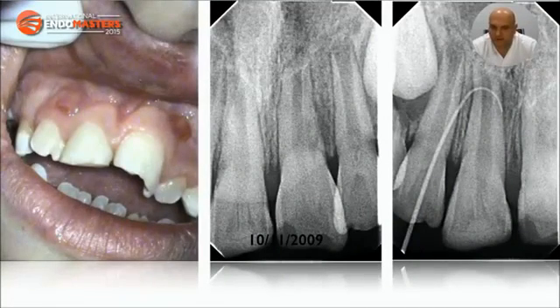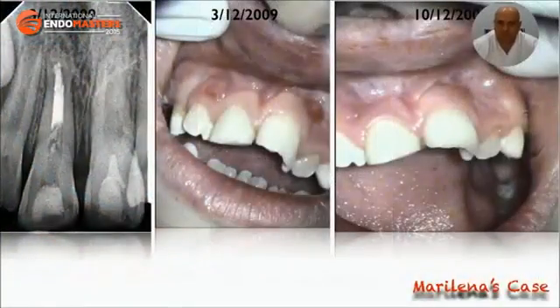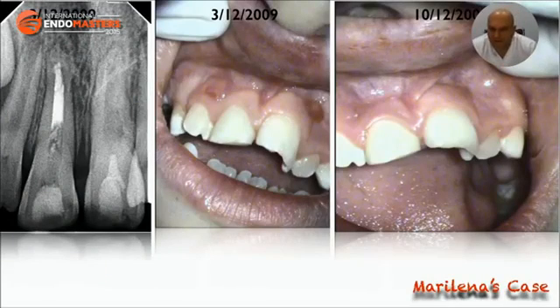So back to little Marlena's case, where we now have to deal with two central maxillary incisors, necrotic, with two sinus tracts. What I did in little Marlena, I assessed both teeth, one at a time, rinsed with 2% chlorhexidine, induced bleeding, and placed MTA over the blood clot.